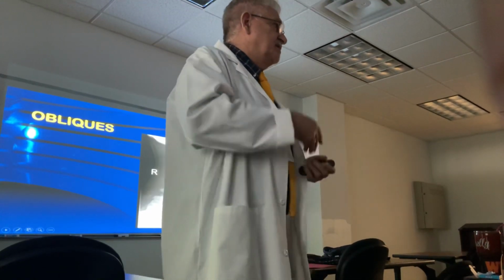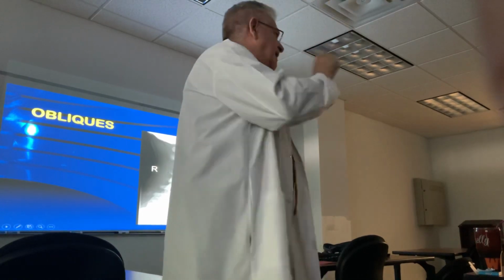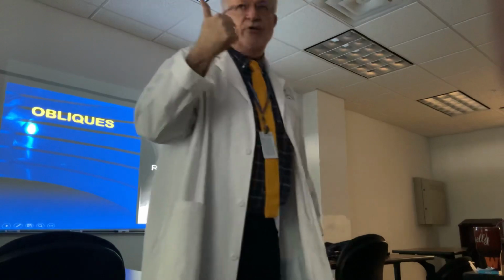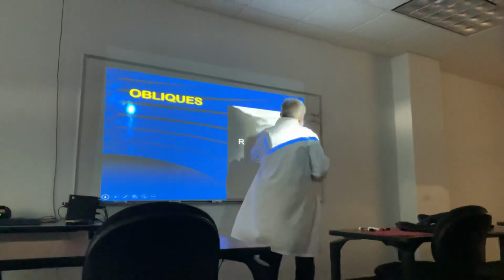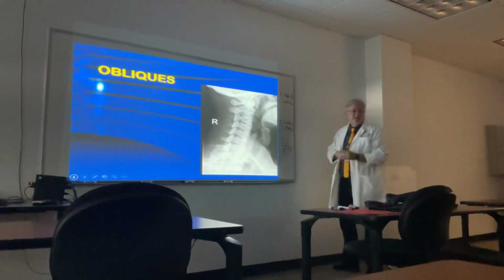My question is, do you have patients with radicular arm pain? Of course you do. You need to know the status of the intervertebral foramen. That's the first challenge you'll notice. The next thing you'll notice is, okay, we do anterior obliques. Well, I haven't had these obliques yet, we haven't learned that in chiropractic college. Just ask them, can you tell me on a cervical left anterior oblique view, which IVF do we see?